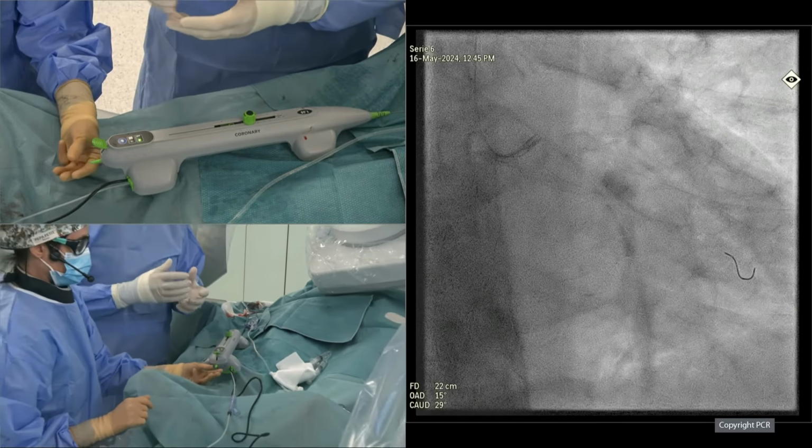Javier, I would like you to clarify one point, if you can, for us. In contrast with rotational atherectomy, where you would exert a forward ablation on the plaque, what you are trying to demonstrate here is that you would start with a backward ablation, right? That's the main difference. Exactly. And perhaps you can show the second slide again for a second, to make it clear for the colleagues. With the second slide, we try to demonstrate that the advantage of doing that is lots of safety.